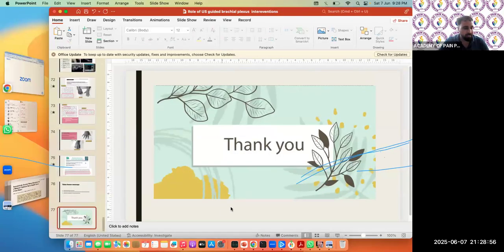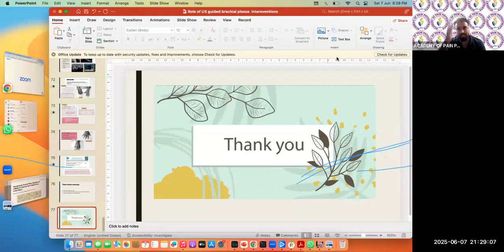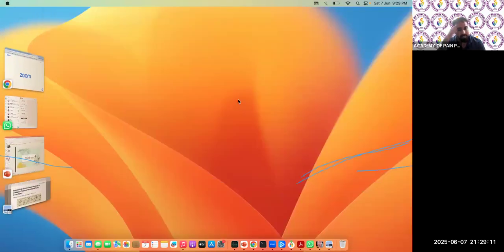It is a very enlightening presentation with in-depth knowledge. We got in-depth knowledge about the brachial plexus, and the message I got from this presentation is that it is not always the C5, C6, C7 trunk. There may be anatomical anomalies, so always scan before injecting your solution.